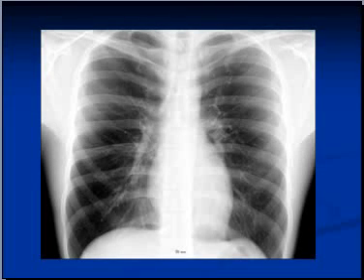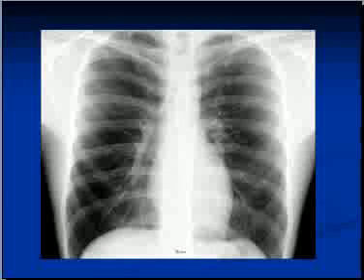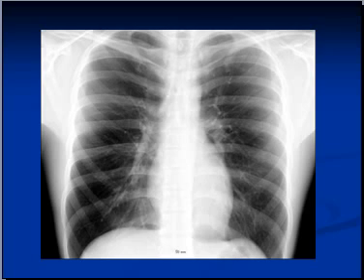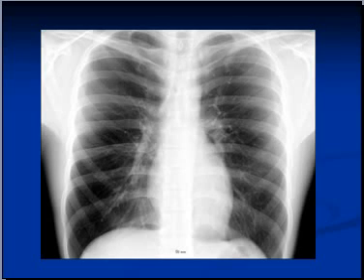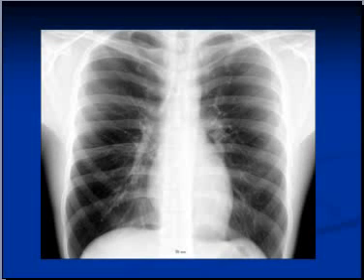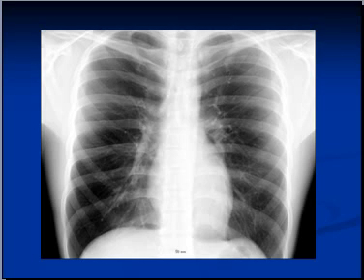The silhouette sign is a powerful tool for radiologists, used not only to confidently detect an abnormality but often to determine the near-exact location of pathology as well. Pathology in the left lingular lobe will obliterate the left heart border, and a radiologist can often confidently say that the pathology is in the lingular region of the superior lobe, often without needing a lateral view — although a lateral view is highly recommended. Similar pathology in the left inferior lobe will usually still show the left heart border.